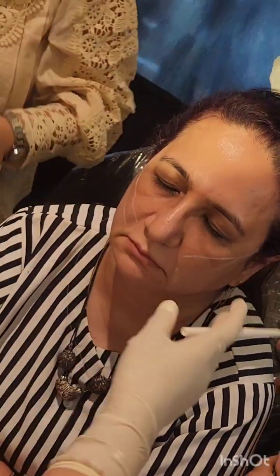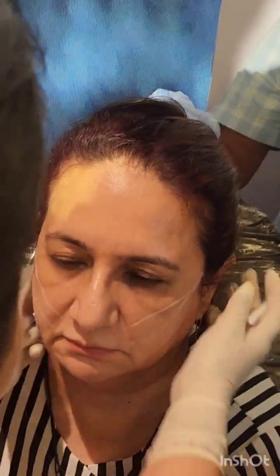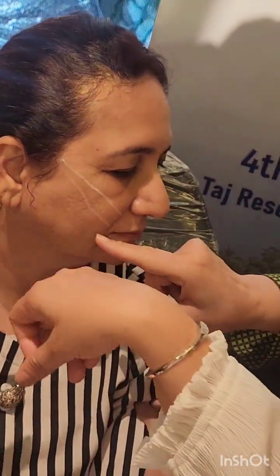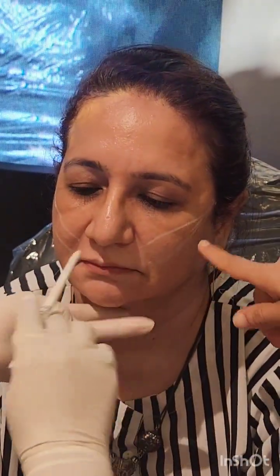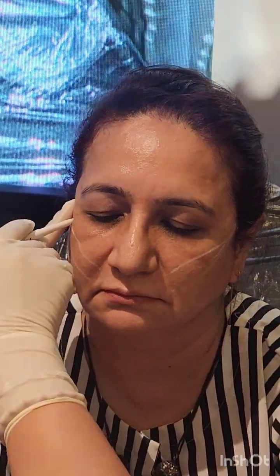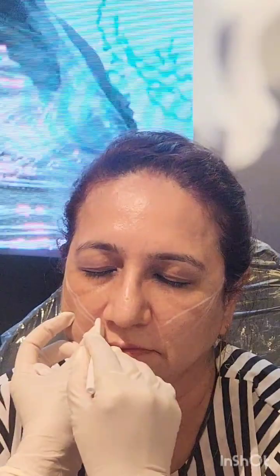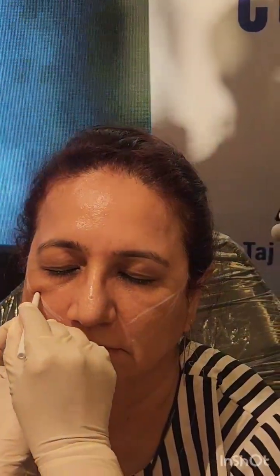So see, is it symmetrical, ma'am? Is it symmetrical? Yes, because the other side we treated. No, it's not. So you can correct it anytime, okay? This line is a little lower than this line, so I'll come and correct it. This is my maximum exit point. Is this symmetrical now?